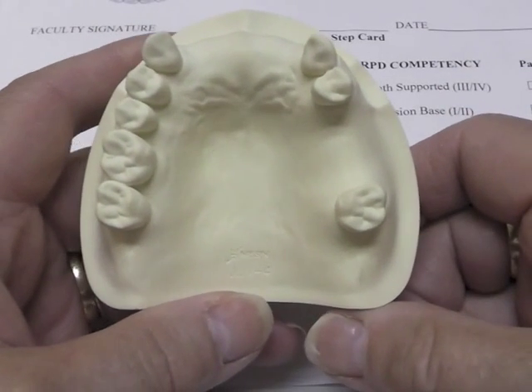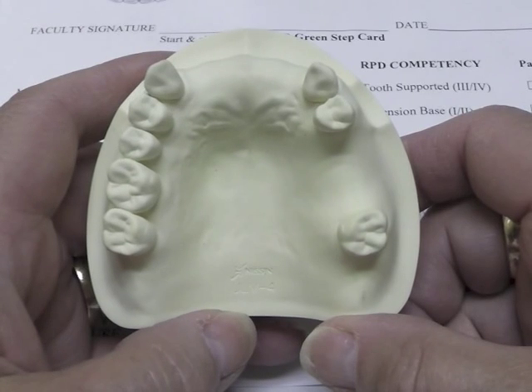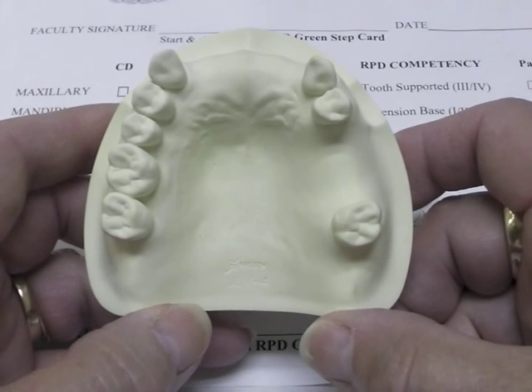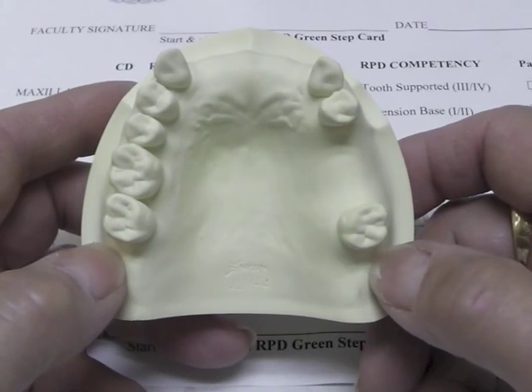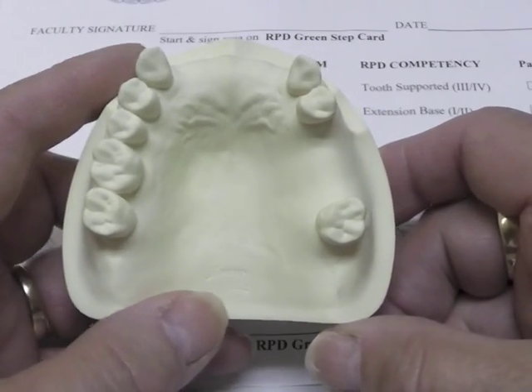The first thing I want to do is evaluate the cast for the placement of a record base and determine where I want to place it and how I'm going to design it. I have a general idea of what I want to do. I do not have to take the flange areas back to the posterior area because of this tooth-supported design.